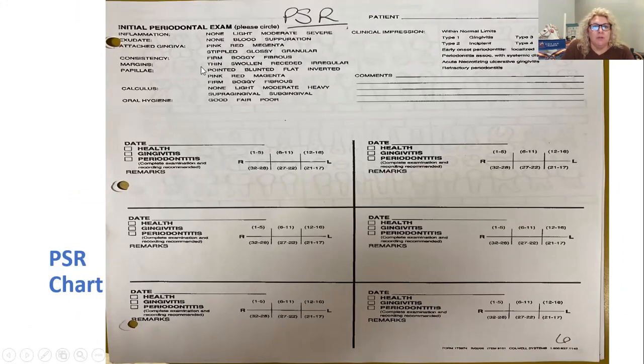And then they're also looking for the margins. They're looking at the papilla. They're looking at calculus. They're charting oral hygiene. And then I can even write down some different comments and different impressions here. So like I can make lots of notes here. The health, gingivitis, periodontitis, they can, and then make notes here as well. So the charts can actually help the hygienist and remind them, what are they looking for? What are they looking at?